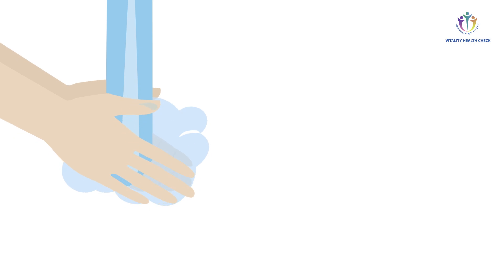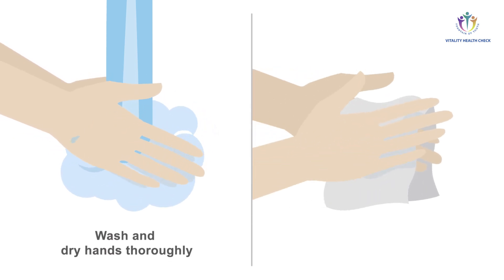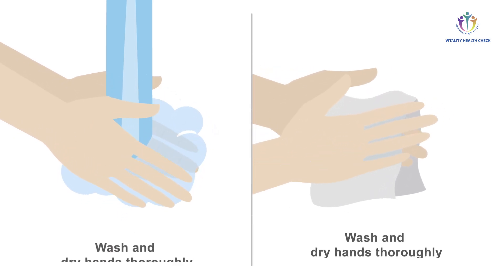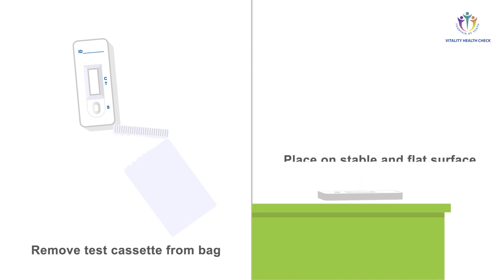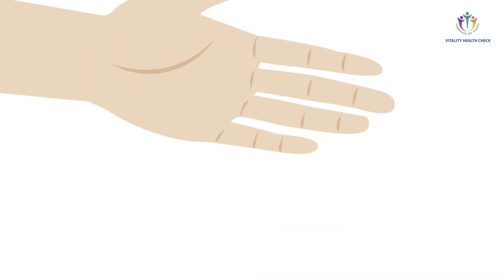After setting the date, you are now ready to run a first test. Make sure the subject's hands are thoroughly cleaned and dried thereafter. Remove a test cassette from the sealed bag and place it on a stable surface. Prepare one uni-sampler device for sampling.